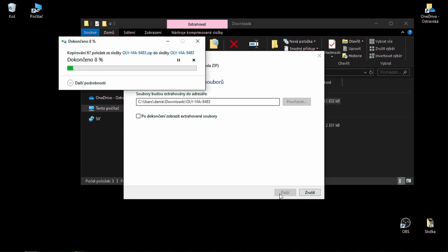This is more or less a useful thing to have. But the problem is with macOS or other operating systems, and also you aren't able to have any sort of application on your phone or iPad, anything like that. It runs only on Windows.